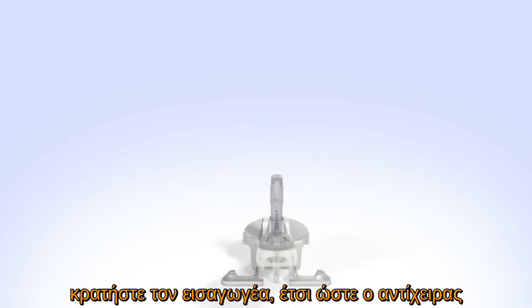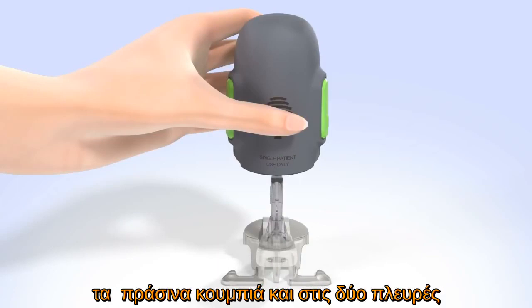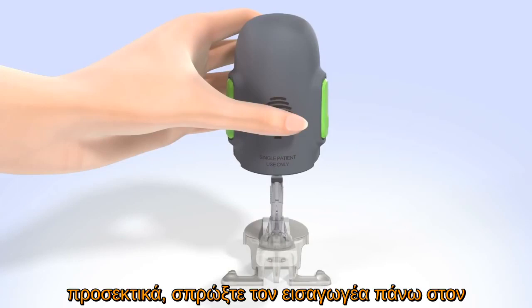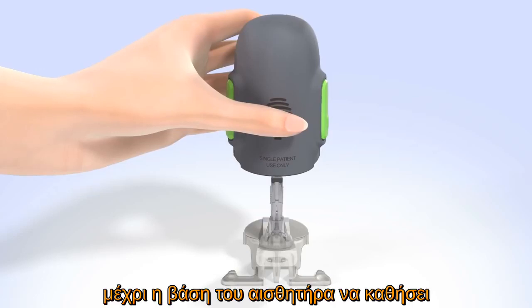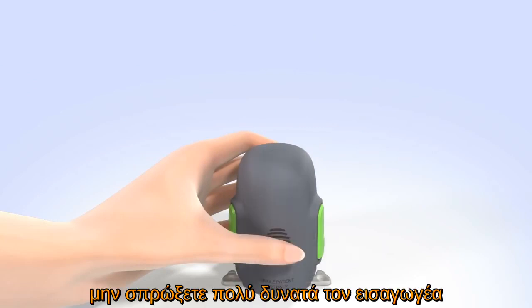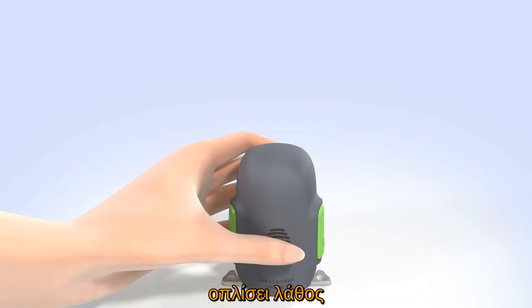Hold the Sertor so your thumb is on the thumb print. Be sure your fingers are not touching the green buttons on either side of the Sertor. Carefully push the Sertor down onto the sensor and pedestal until the base of the Sertor sits flat on the table and you hear a click. Do not push the Sertor too hard onto the sensor as this might cause the sensor to load improperly.